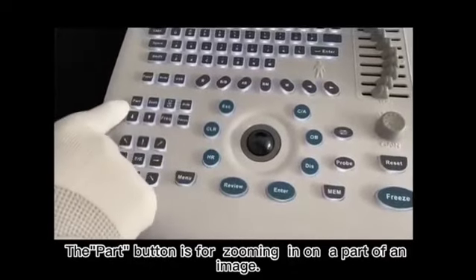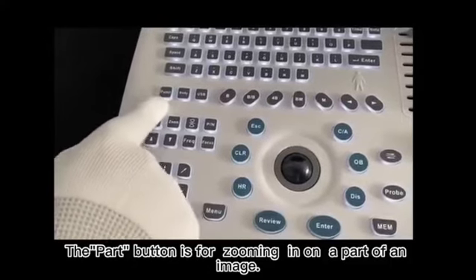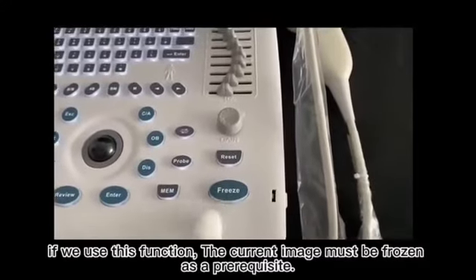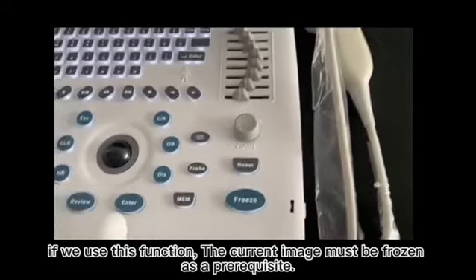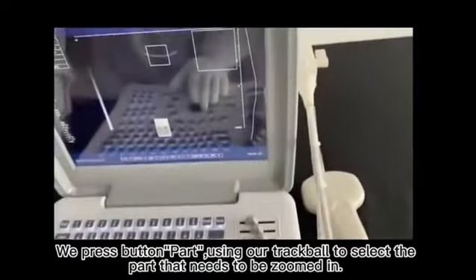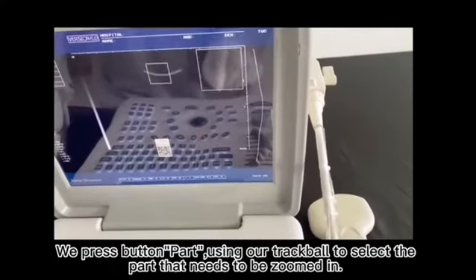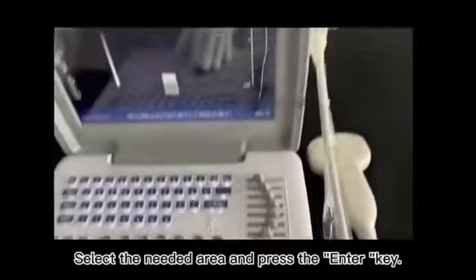The part button is for zooming in on a part of an image. If we use this function, the current image must be frozen as a prerequisite. We press button part and use our trackball to select the part that needs to be zoomed in. Select the needed area and press the Enter key.